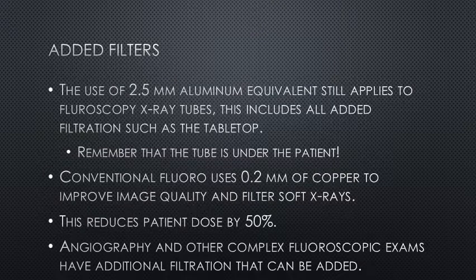Another component is filtration. The use of filtration is the same. You have to have a minimum of 2.5 millimeter aluminum equivalent, and you have to remember that some of that filtration is added, and that comes from the tabletop because the tube is underneath the patient.